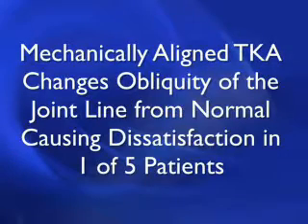So let's look at our first point. The mechanically aligned total knee arthroplasty changes the obliquity of the joint line from normal. Let's look at the evidence we have for that, and then we'll show you that by doing so, we think this is what causes our dissatisfaction.